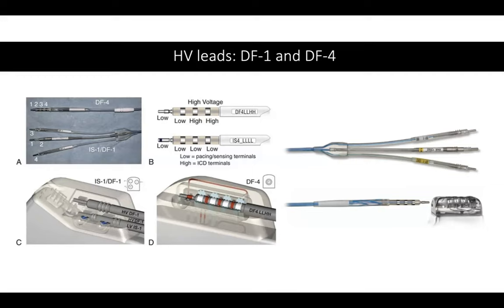Yeah. So Dr. Ijoma, the point you are making is that multiple checks are what we should do. Even though you know it is this, always read out what is written on that particular plug before you go ahead and put it. Yeah, I think that's a really good point, Dr. Ijoma.